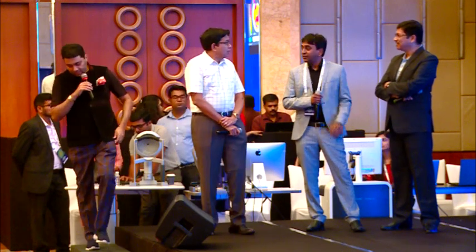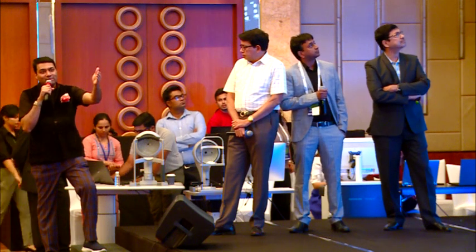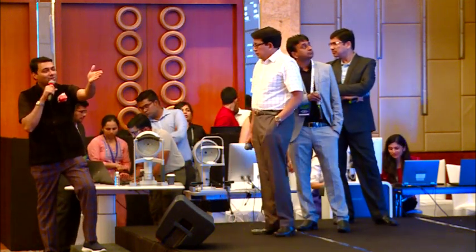Go back to the second case, where the second time, 13. Even though it's scary that you know that you're treating an axis which is not what the patient accepts, based on the first talk we gave, the patient cannot accept that axis because it's a higher order aberration. And even if you go back, ask your optometrist to re-refract, you will not get 13. You'll get 30 only because the patient.